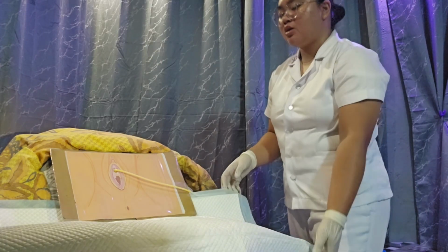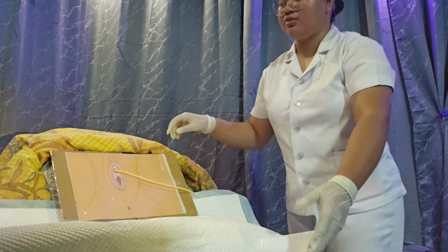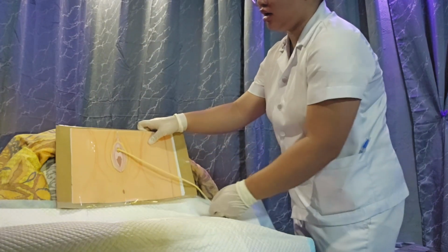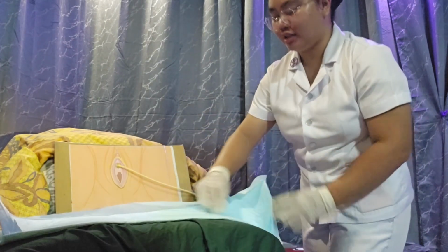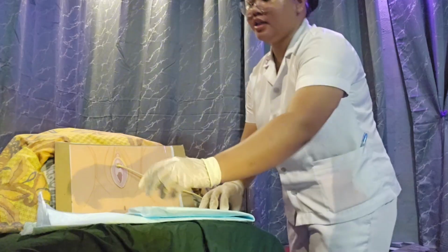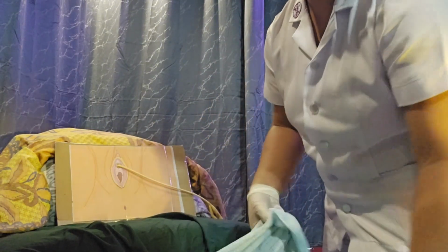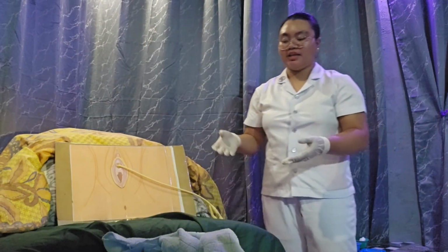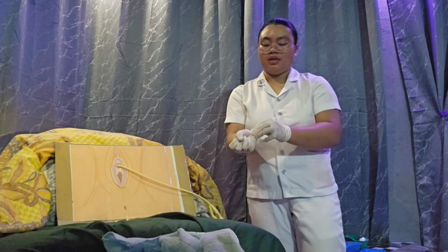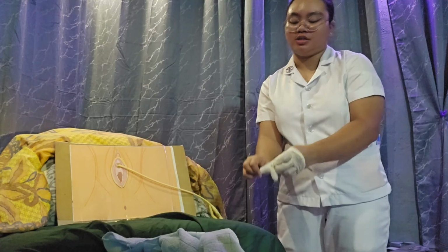Okay po. So after that, we are also going to do the aftercare of the materials that we've used to maintain the cleanliness of the area. And then after doing the aftercare, we are also going to document the procedure that we did, as well as the size of the catheter and the necessary observations that we have observed.